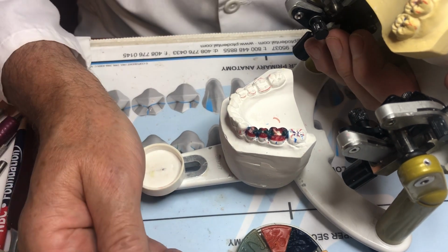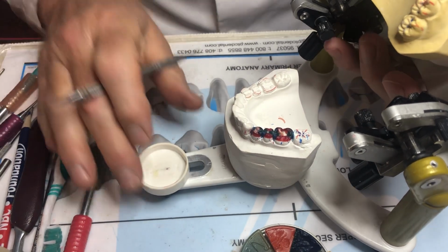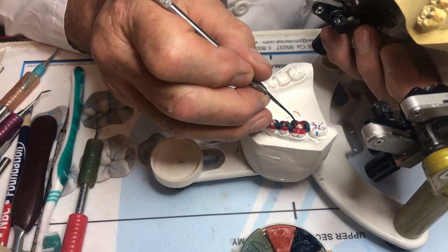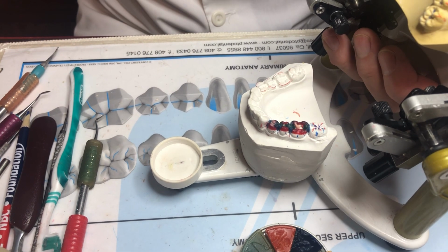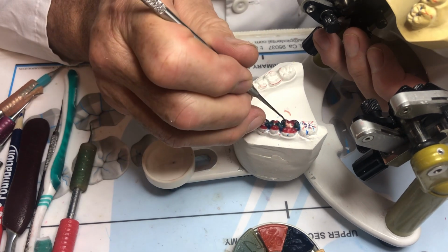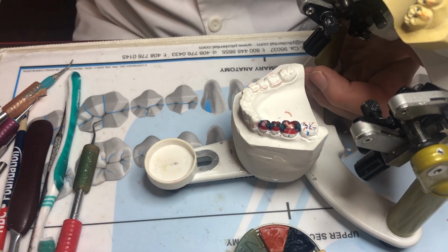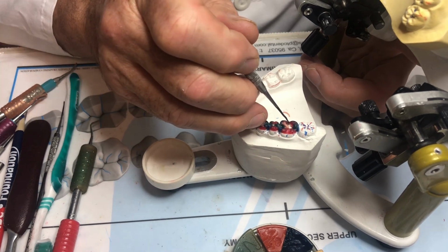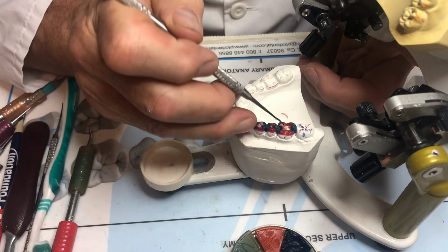So let me keep going, and then in a second I'll close the articulator and see if I've reached that contact. Close it down. Yep, just showed up. So again, I'll be doing all of this in the laboratory. You'll see it much better. We have a video visualizing machine, so this will all be projected up on a very large screen. So either you can come up and watch it when I do it, or you can sit at the lab bench and you'll be able to watch it. I'll zoom in and you'll be able to see it, and the videos will be posted on Blackboard anyway for you to watch at other times.